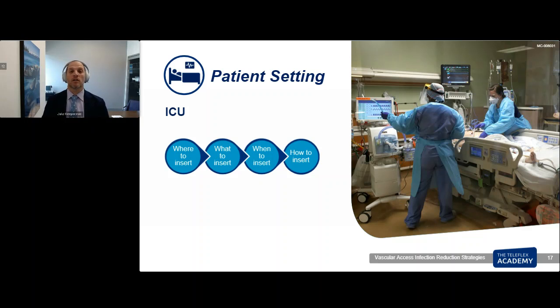It's incredibly important if somebody does have a catheter that the site is cared for appropriately, that the dressings are changed, that a soiled dressing is changed immediately, that there is some protective barrier like a biopatch between the skin and the dressing, that people are appropriately washing their hands and changing dressings using appropriate aseptic technique. These are all essential, again, to preventing infections and improving our patients' outcomes.